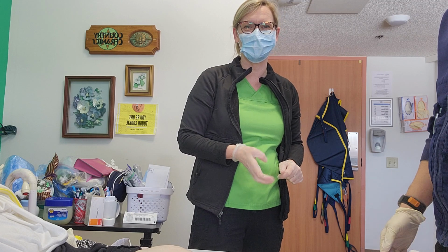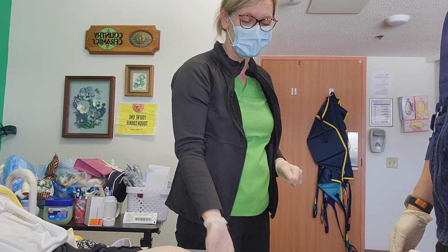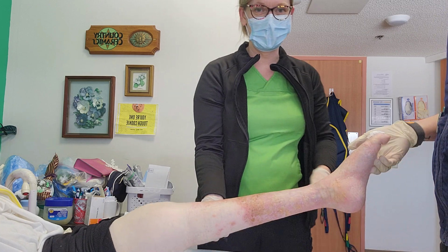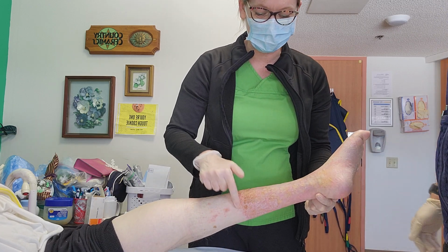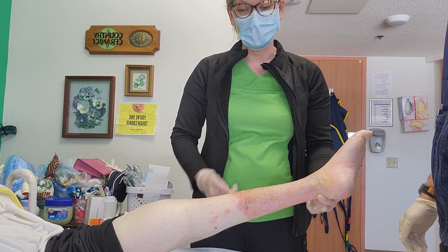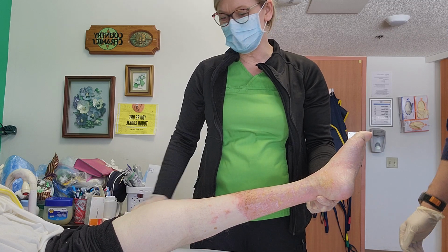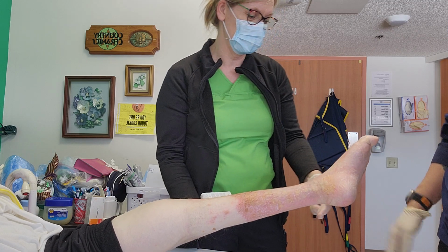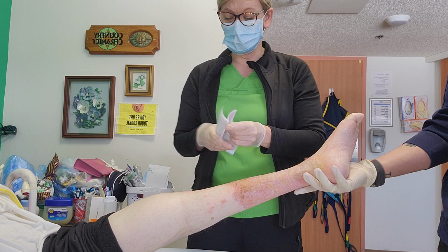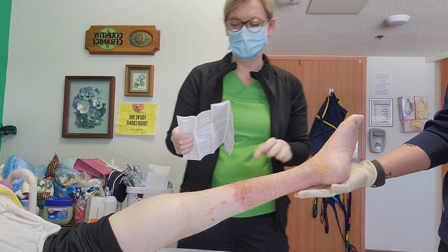We're actually going to show the use of Viscopaste, especially in stasis dermatitis. So I have this lovely lady with her leg that's got quite a bit of erythema that develops. She has chronic venous stasis disease, mainly because she's immobile and unable to flex her calf muscle. So Viscopaste is a zinc impregnated cling that when applied to the leg can actually really soothe the dermatitis.